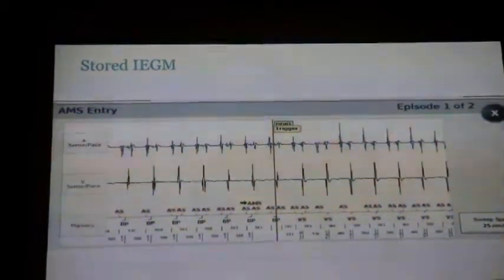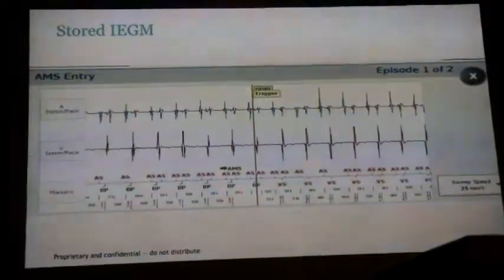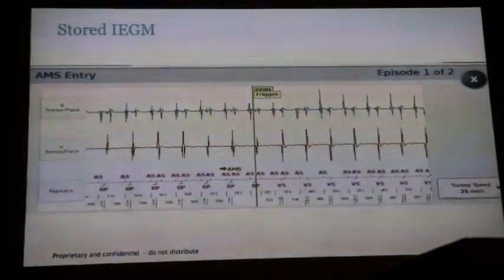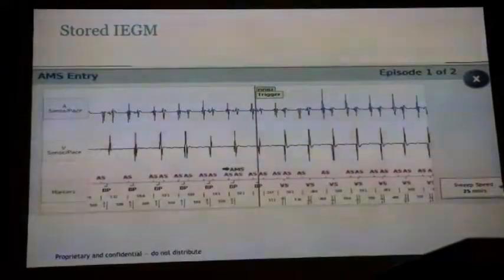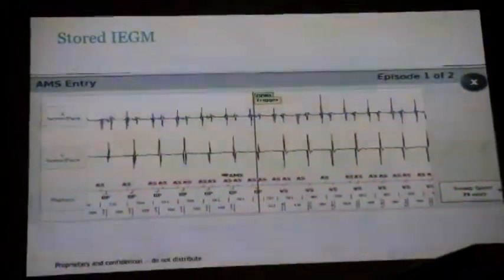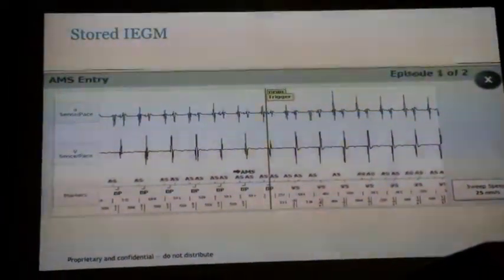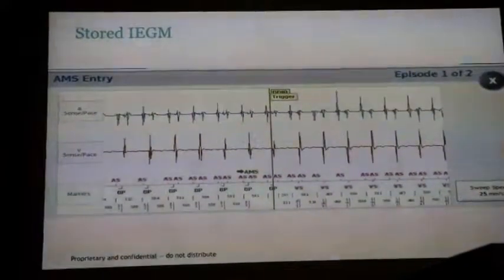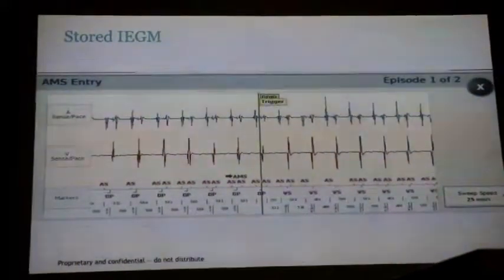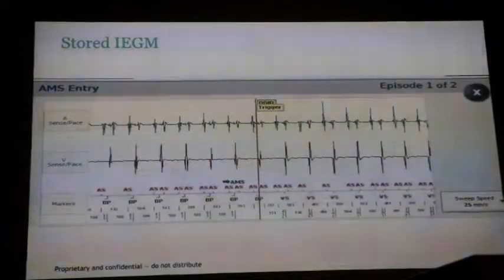Correct, absolutely. And this is the problem, right? You lose BiV pacing. The device goes to a non-tracking mode. The patient's in sinus rhythm, though, he conducts through his AV node, so the device doesn't track, right? So now we lose BiV pacing, and then the baroreceptors maybe are detecting a drop in pressure, so they start to go, okay, drop in pressure, trigger the whole system, trigger things off again, right? So this patient might have started decompensating as a result of just a far field R wave, which is insignificant, or we think it's insignificant, right?